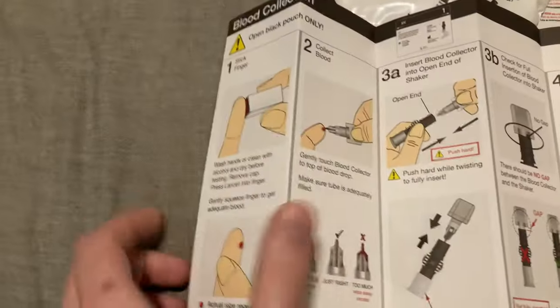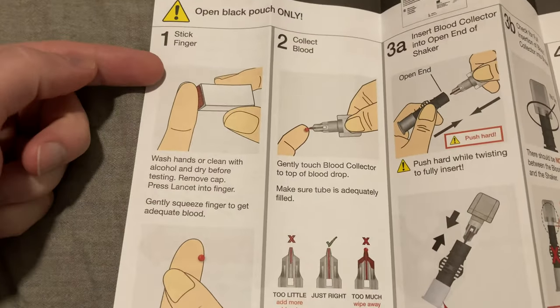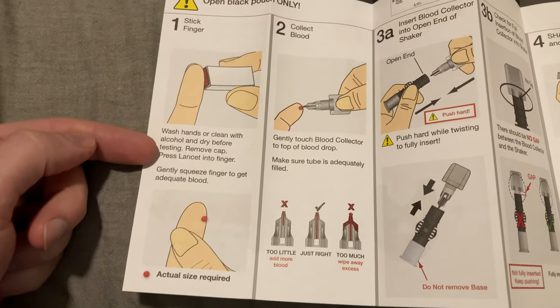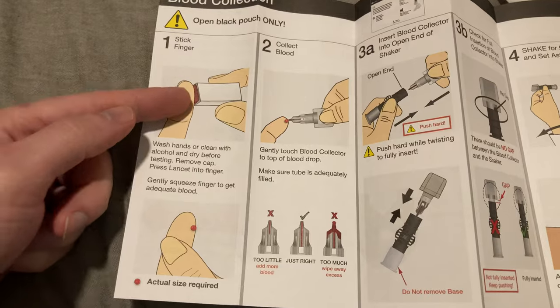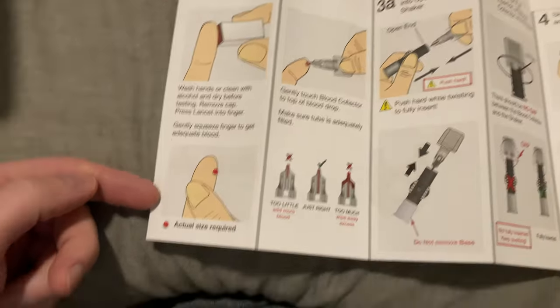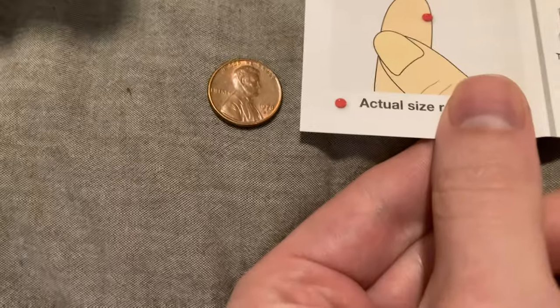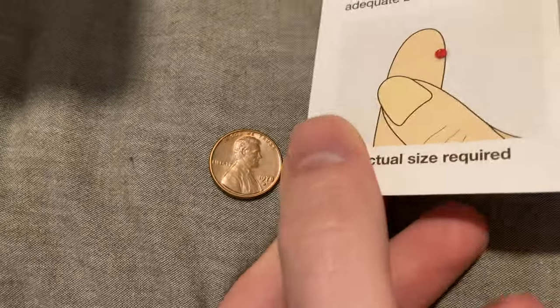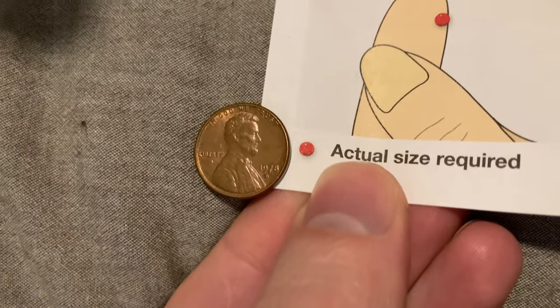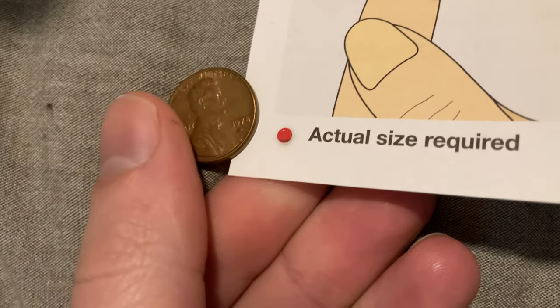Here's the guide. So we're going to go through this on the video here so you have the instructions. You use their finger stick device and you clean your fingers before you do this. And this lancet, when you press it, is going to perforate your skin. And you need a dot size. So to give you an idea of how big that is. Okay, so for size comparison here, compared to a copper US penny, that's about the size we're going for. So a little bigger than the text on a penny.